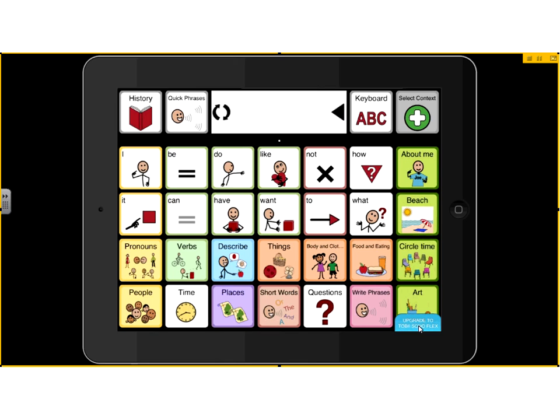This is different from some of the other AAC apps. It's a very good one. I've heard from many of my speech and language pathologist friends that Sonoflex Lite is one of their favorites, because of the way that it allows you to build what you want to say, because it seems like a simple and pretty easy association with nouns, verbs, adjectives, and so on, and it allows for language development. This happens to be a favorite one, and from what I've found, this tends to be a really good app as well.